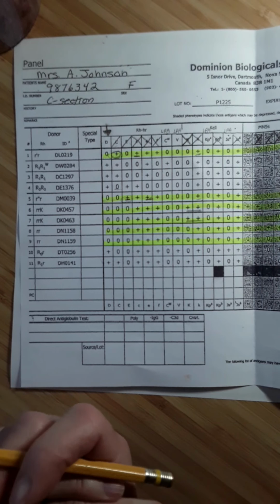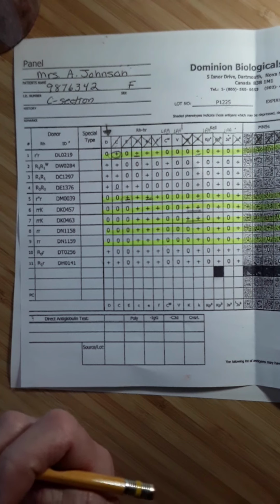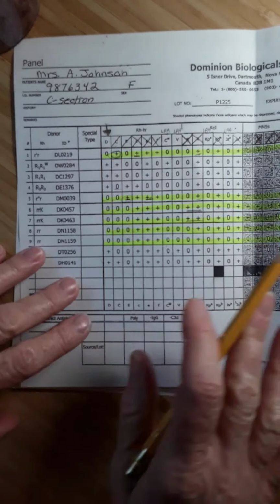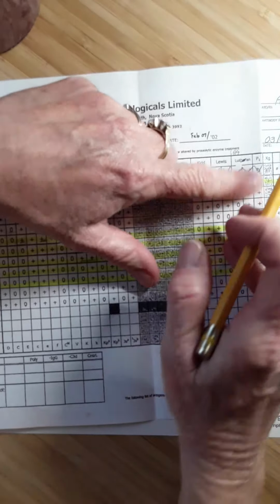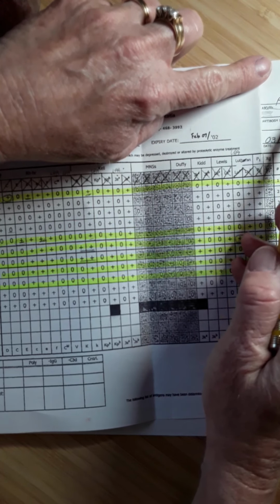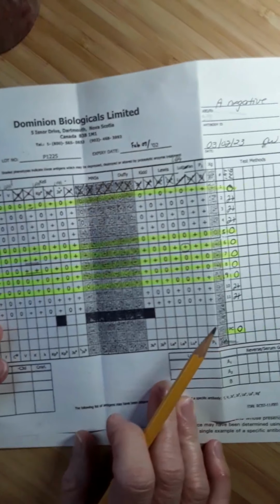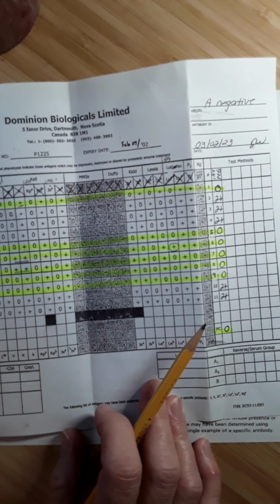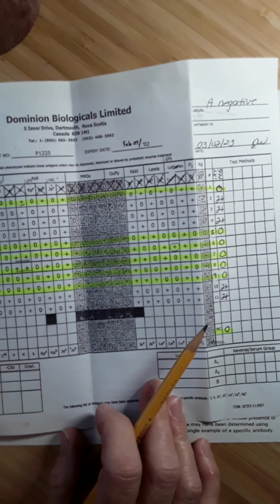In addition, on page 10, we're going to antigen type donor units, which is really important. We don't need to give Mrs. Johnson donor units that have the D antigen. So we will go to our fridge actually. And it makes it pretty easy when somebody has an anti-D because we'll just choose some A negative donor units for Mrs. Johnson. And we won't actually need to D-type the donor units because that's already been done once by Canadian Blood Services and then once again by the hospital site that received the blood units. They would have D-typed them a second time. So they're confirmed to be D negative.